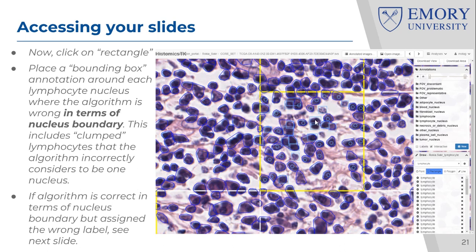So what you do is you place a rectangle as tightly as possible around it. Okay, don't make the rectangle too large or too small. Just make it exactly, to the best of your ability, of course, around that cell. So, rectangle here, rectangle here, and so on.